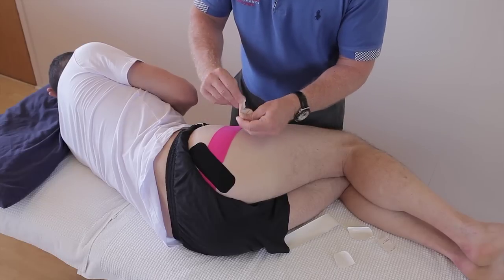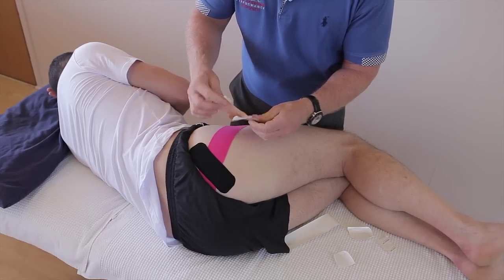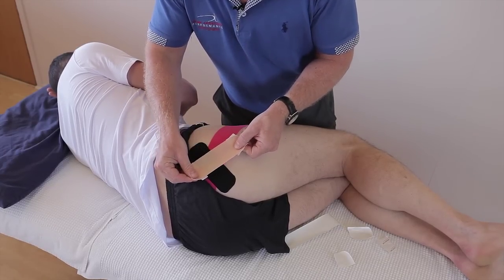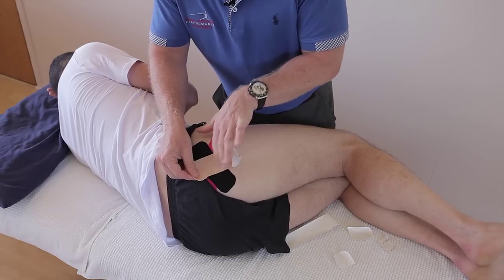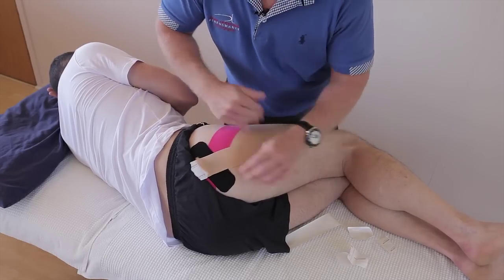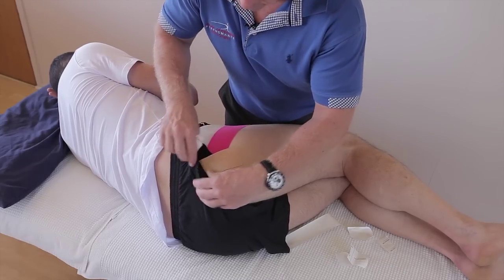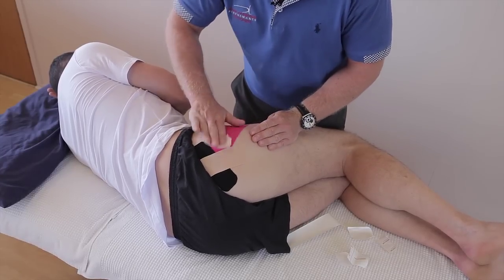Then the second strip — peel that back. It can be a little fiddly. Apply that directly over the pain, stick the first part down, then pull that and feed that end along like the end of the shorts there. Use the back of the tape to activate the glue.